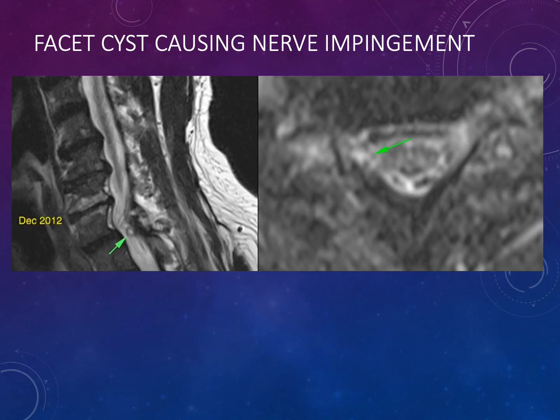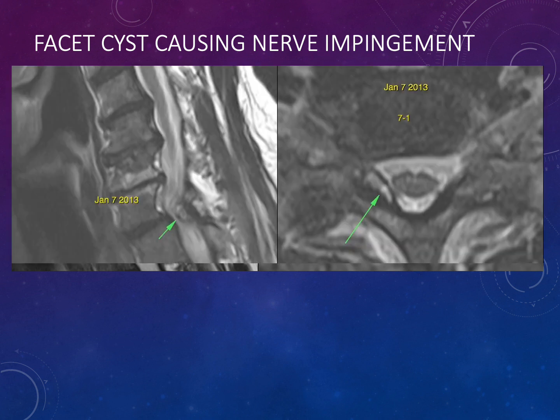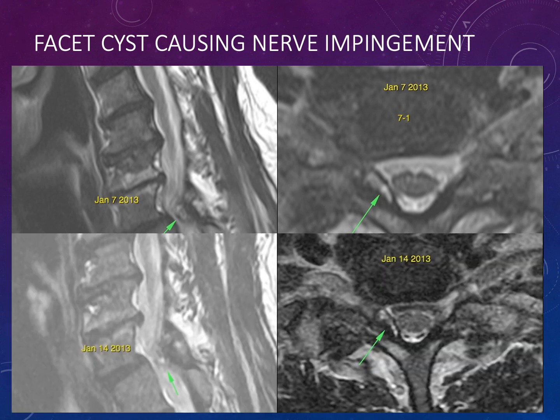Here is an example of a patient with facet arthrosis and a very tiny facet cyst causing impingement on the nerve root. One month later the cyst has increased significantly in size, and it remains persistently large thereafter. When you have facet arthrosis, facet cysts can develop and impinge upon the nerve roots, so you should look carefully for them.